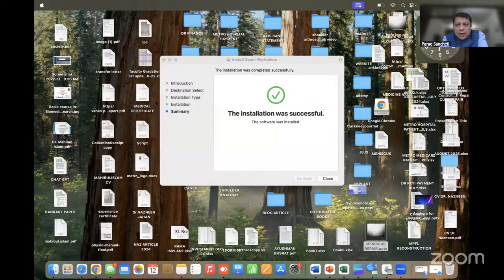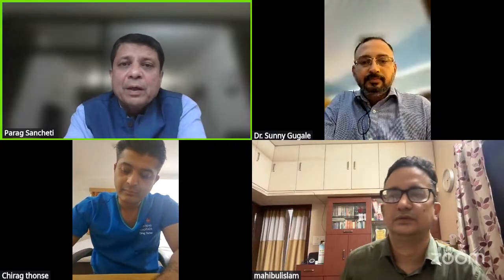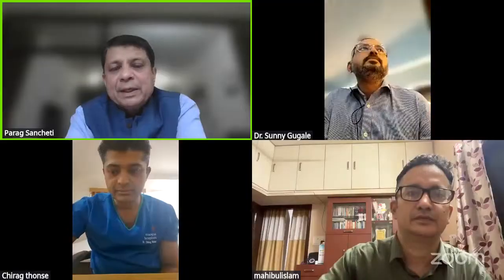Dr. Chirag, what are your indications that you will not attempt a repair? You know, we've always had the dictum that save the meniscus, the red, of course we have to suture, but red and white also we are attempting to repair. But which are the cases that you would now think I have to do a meniscectomy or partial meniscus resection?